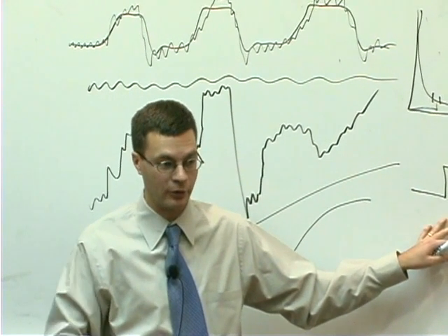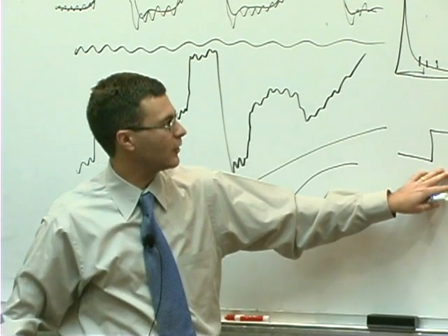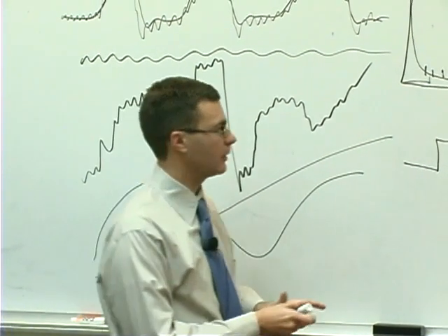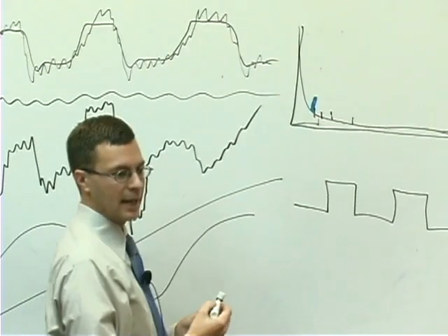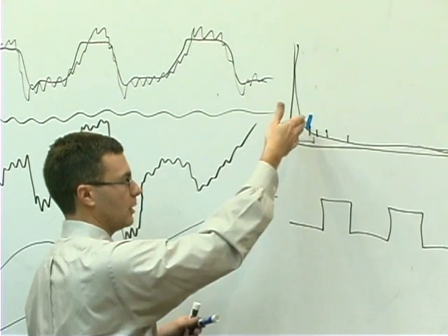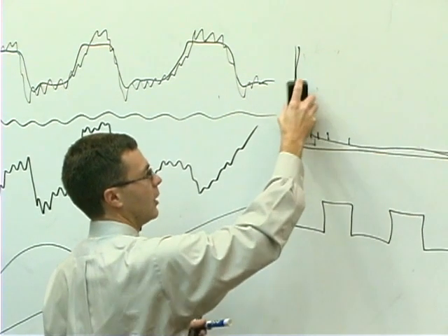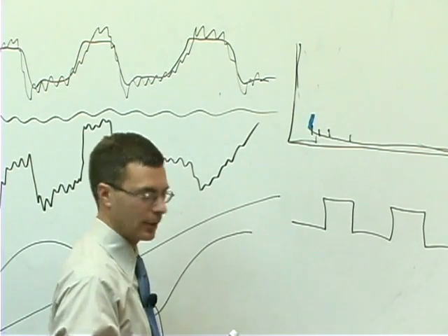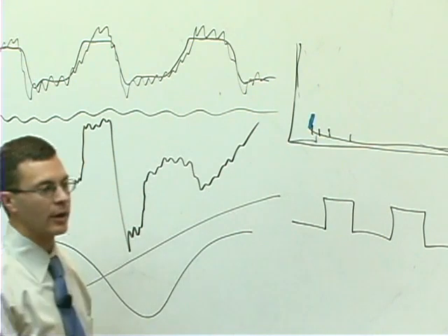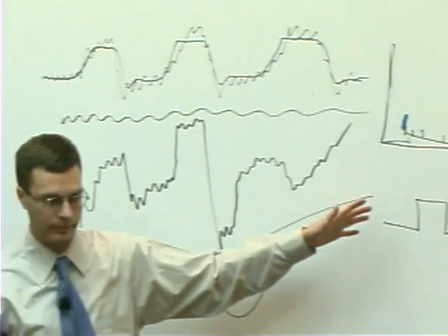The neuronal activity you're interested in is 30 seconds here, 30 seconds there. In that case, most of your experimental variance is going to be concentrated at one of these low frequencies, down here. And almost all of your experimental variance will be at that frequency. So you can safely remove all the frequencies below that point without much trouble at all. Okay? In general, block designs are the ones that benefit the most from this kind of low frequency filtering.